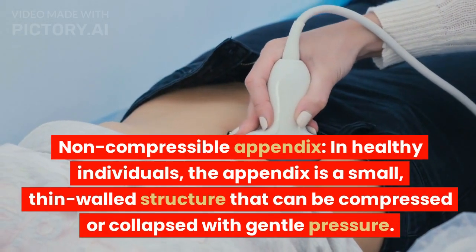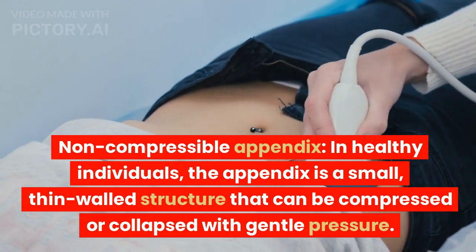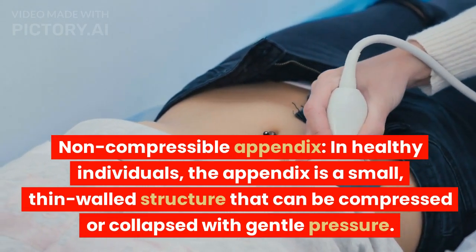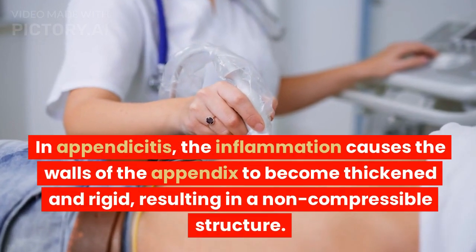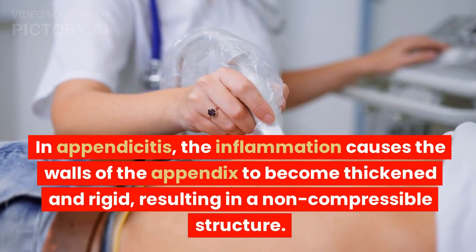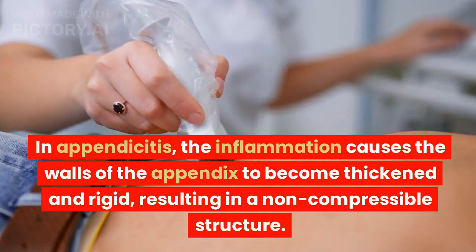Non-compressible appendix. In healthy individuals, the appendix is a small, thin-walled structure that can be compressed or collapsed with gentle pressure. In appendicitis, the inflammation causes the walls of the appendix to become thickened and rigid, resulting in a non-compressible structure.